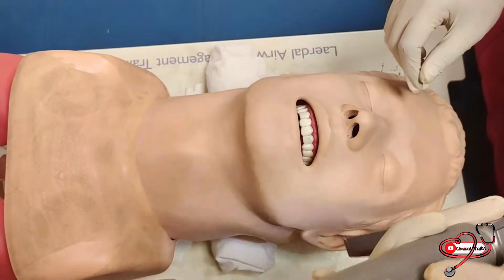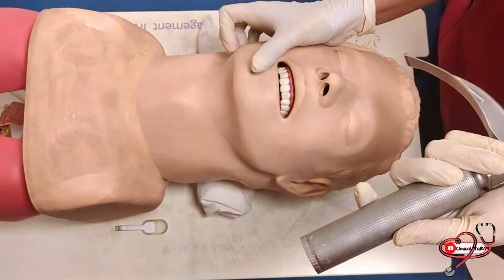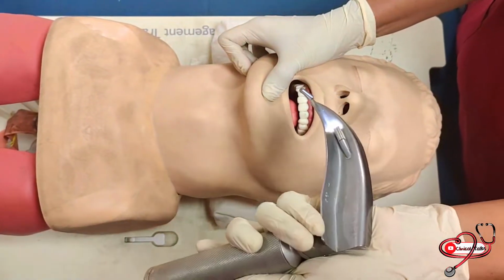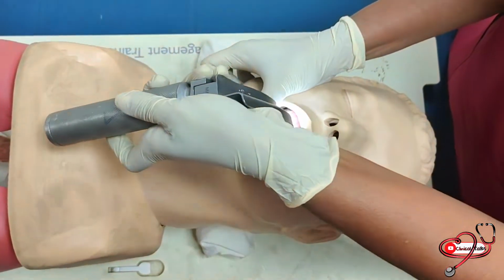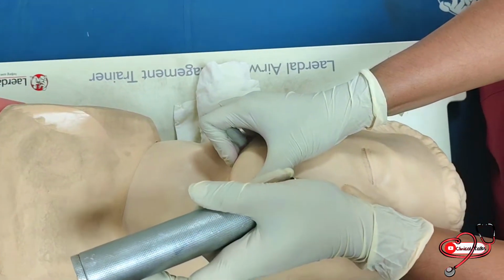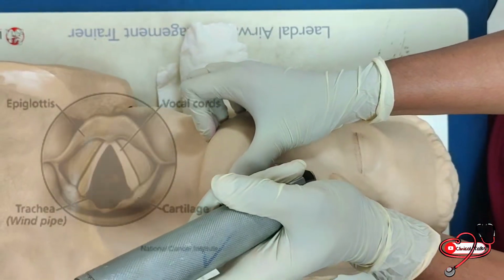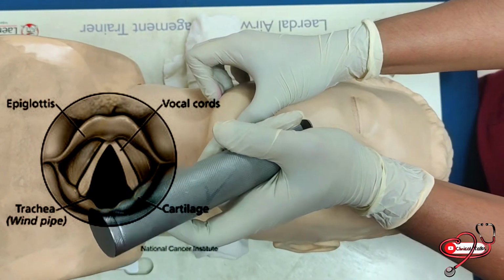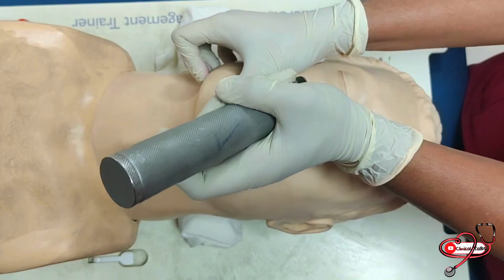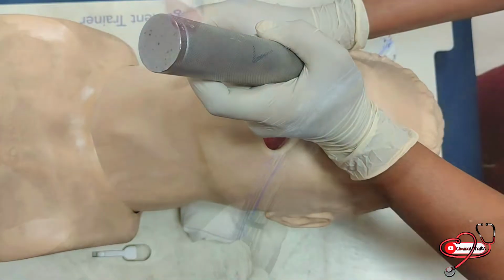You need to hold the laryngoscope in your left hand. With your right hand, open the patient's mouth, and then introduce the blade into the mouth from the right side and push the tongue towards the left. Then advance the laryngoscope blade, you will see the epiglottis, and lift up the epiglottis by pushing at the back of the epiglottis, you will see the vocal cord.